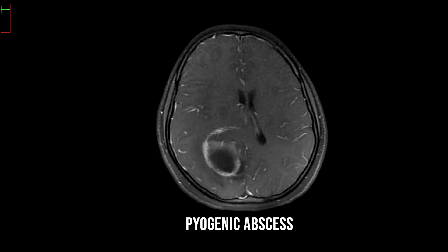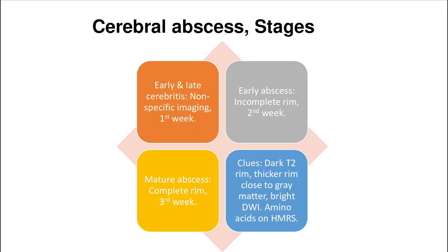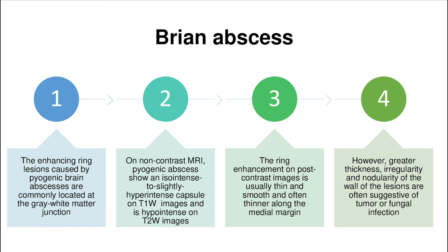There is uniform homogeneous diffusion restriction and a thin smooth rim of enhancement, which is classical for pyogenic abscesses — so this is a case of pyogenic abscess. In cerebral abscess, early and late cerebritis show no specific imaging features. Early abscess shows an incomplete rim appreciated in the second week. Mature abscess in the third week shows complete rim enhancement. Pyogenic abscesses are commonly located at the gray-white matter junction. On non-contrast MRI, the capsule is iso- to slightly hyperintense on T1 and hypointense on T2, with thin smooth ring enhancement often thinner along the medial margin. Greater thickness, irregularity, or nodularity of the wall suggests fungal infection.